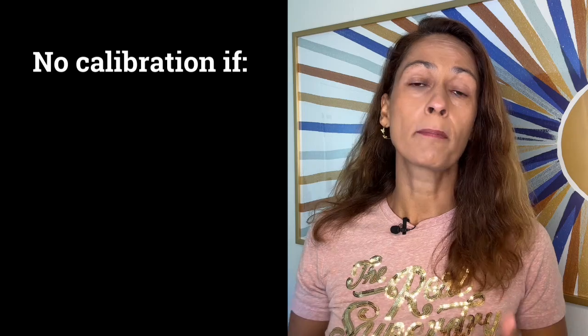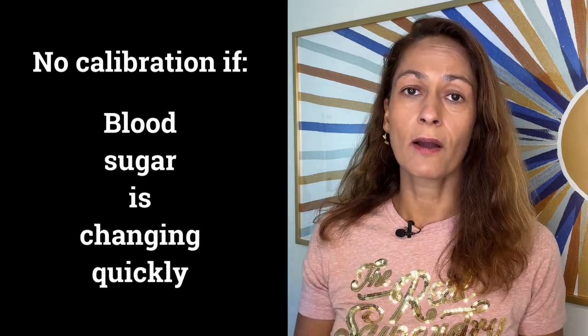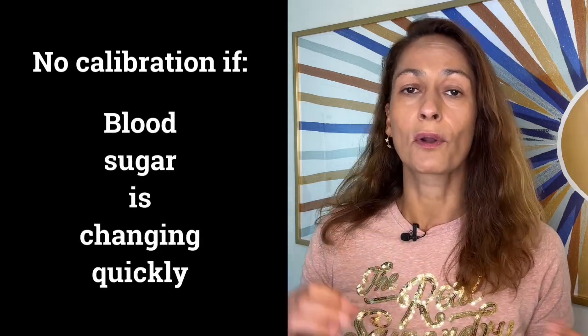Because if we have a Dexcom, there is something we can do, and that is to calibrate the sensor. My approach to calibration is that I don't act just because I see a single glucometer reading that's more than 20 milligrams per deciliter different from a CGM. Often, I find that the CGM will correct itself. So I need to see more than one reading that's more than 20 milligrams per deciliter off. And I don't calibrate if my blood sugars are changing quickly, because as we talked about, the fluid is about 5 to 10 minutes behind what's going on in the bloodstream. So I would actually expect my blood sugar readings on my meter and my CGM to be different in a situation like that. But let's say that I've seen several readings where my sensor is significantly off.